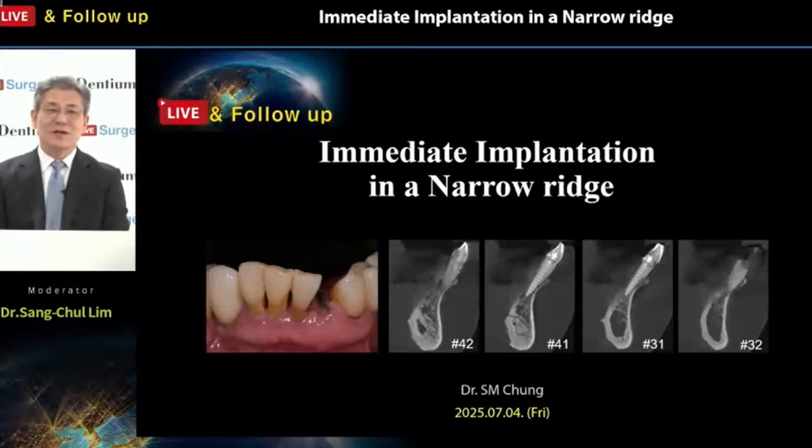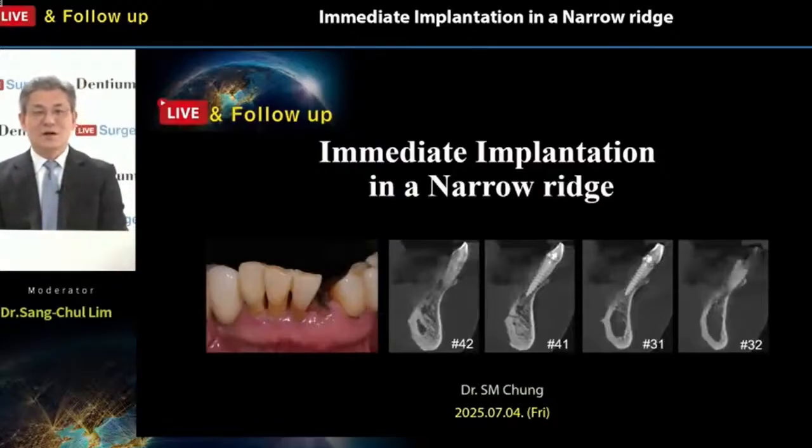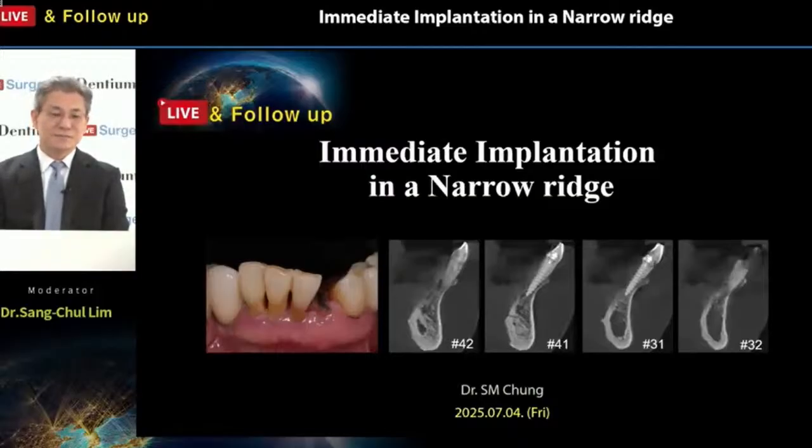As always, today's live surgery will be performed by Dr. Chung. The topic for today is immediate implantation in a narrow ridge. Through today's surgery, you will be able to learn how to manage the lower anterior area, which is a periodontally compromised situation. Let's take a look at today's case.